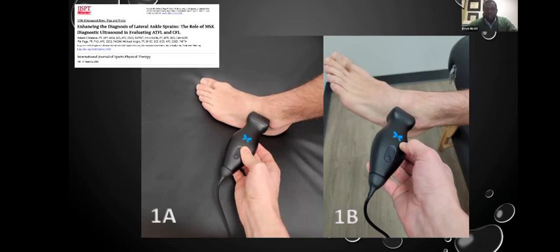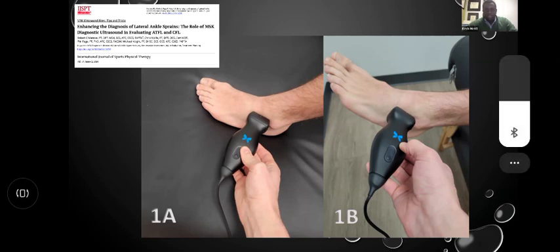And in some cases it's helpful to just have their leg, or a foot in this case, hanging off the table, so that they have freedom. It's also easier for you to move in order to do the different dynamic stress maneuvers that may be required in order to make the diagnosis.